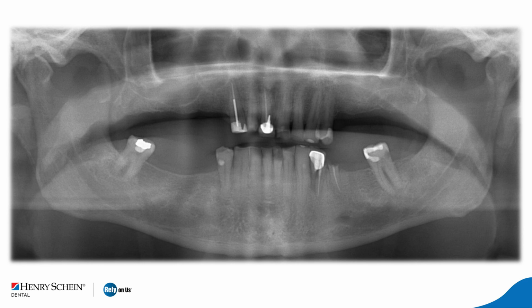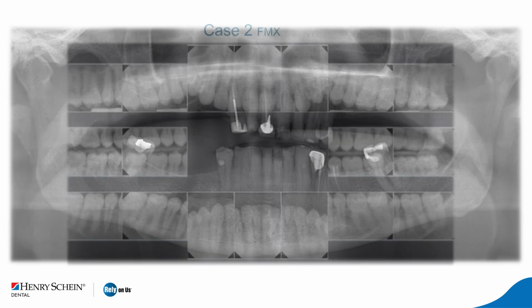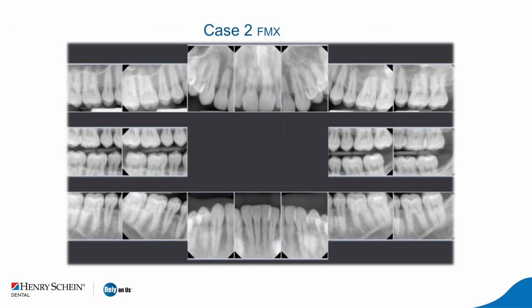And the also very important question that I ask is, would you take some more radiographs to be able to treatment plan accordingly with implant surgery, or would you go ahead just with a panoramic like this one? And then we'll go to the second case, also one that you could see in your offices.